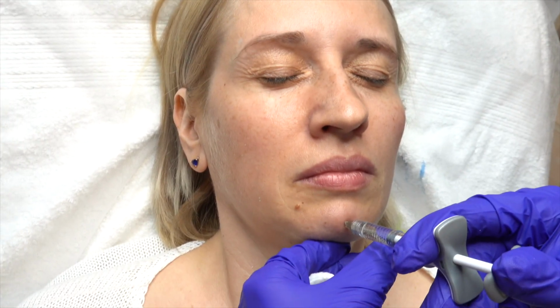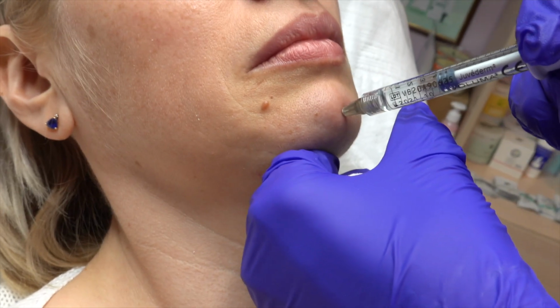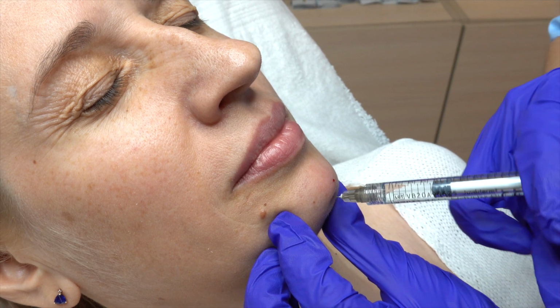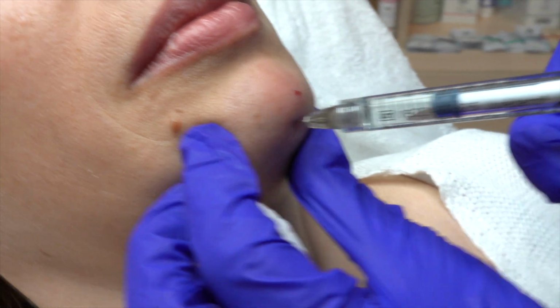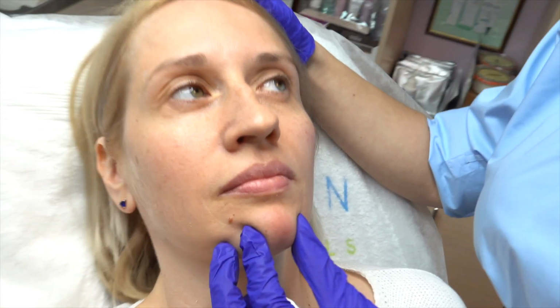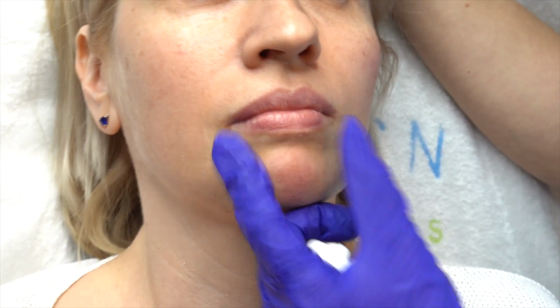0.2, 0.3 cc I add here. Now it's 0.2 and an additional point for the chin. And you already can see that the chin becomes slimmer, becomes more defined, and look at her lower lip. It has become a better position of the lower lip.